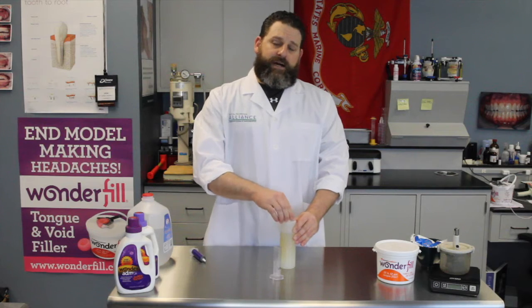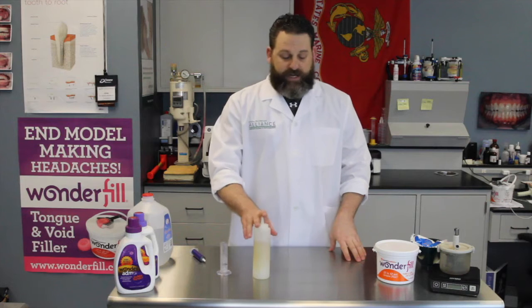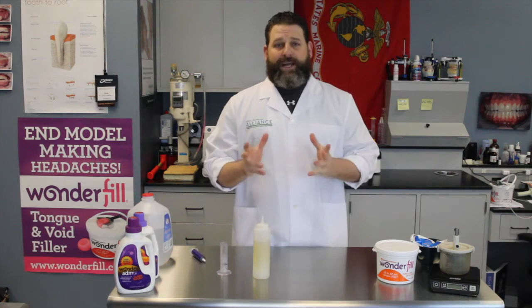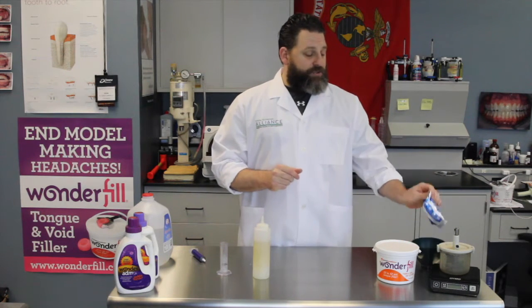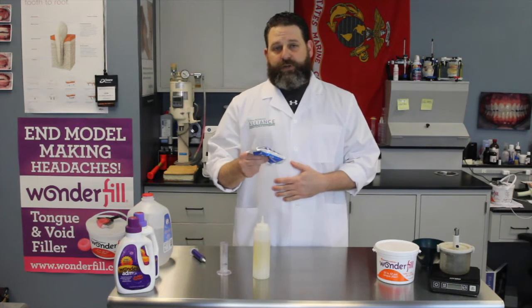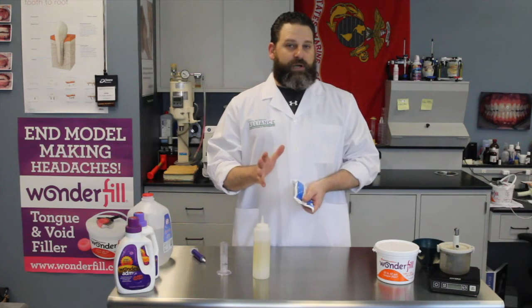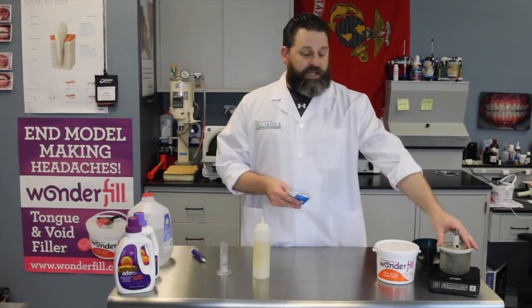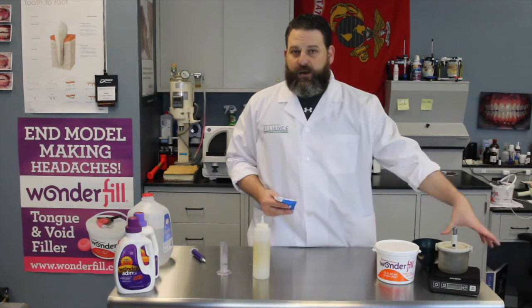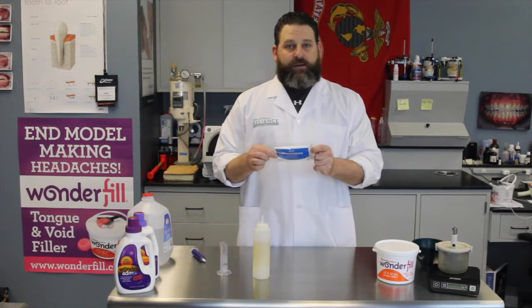So now that we have our proper AdMix all mixed up and ready to go in our ketchup container, we're going to have to know what stone we're going to be using. For the average stone that you're going to be using for an alginate impression, what I use is Whitmix's Micro Stone. Why? Because it's already pre-weighed. In the laboratory, we have about five to six different stones for the different appliances that we're making. The Micro Stone is already weighed out for us.